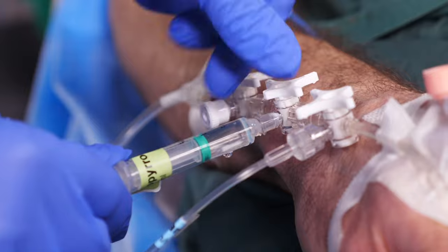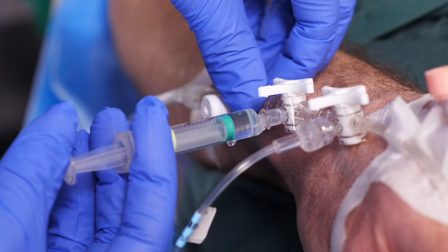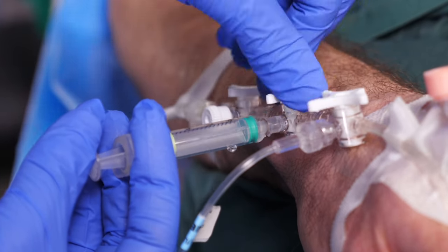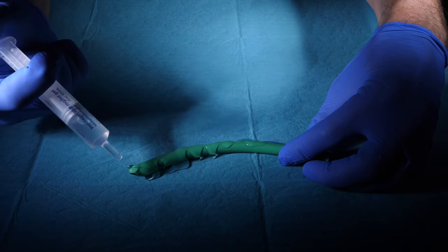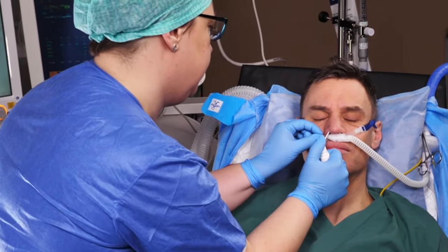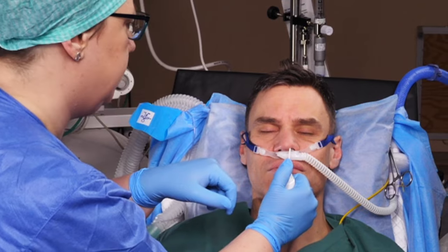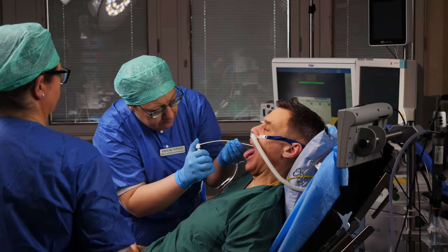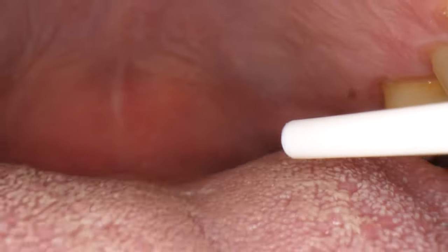Next, topicalize the airway — the importance of which cannot be stressed enough. Consider glycopyrrolate, which reduces salivation and thereby makes the applied local anaesthetic more effective, but note that it has to be administered at least 20 minutes before the procedure. A lidocaine gel-coated nasopharyngeal airway is a good way of starting to anaesthetize the nasal cavity. Next, start spraying using a local anaesthetic containing a vasoconstrictor — first nasally, and then orally. DAS recommends 20–30 sprays over a 5-minute period. This may feel excessive, but it is the key to effective topicalization.